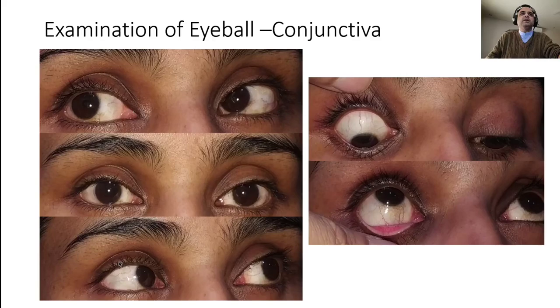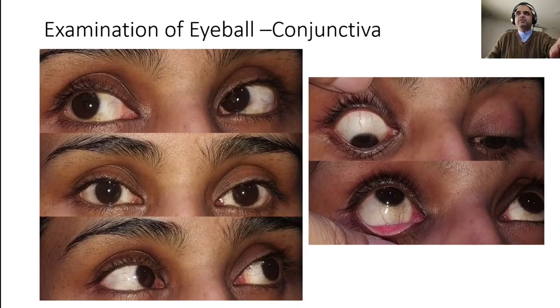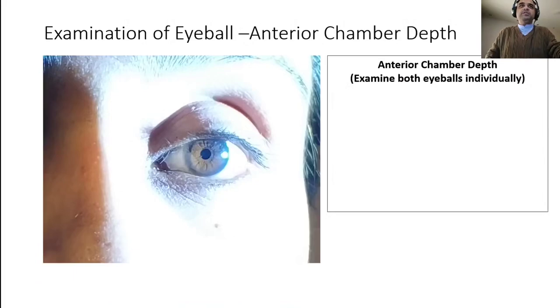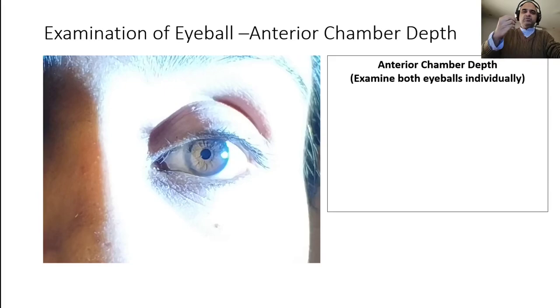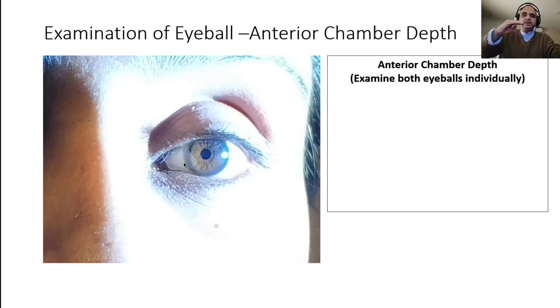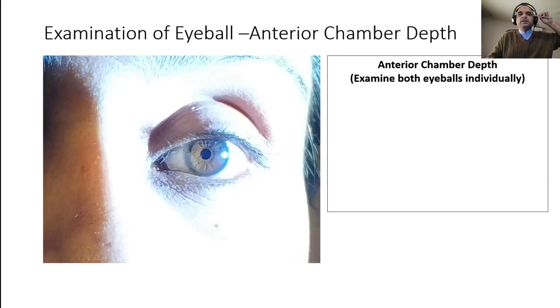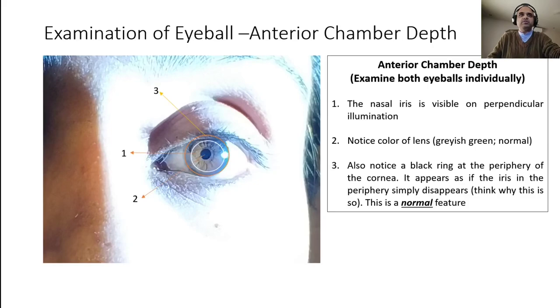Finally we check the anterior chamber depth. After checking the conjunctiva, cornea, iris, pupil, and lens, we assess the anterior chamber depth. The anterior chamber helps drain the aqueous humor through the trabecular meshwork into the Canal of Schlemm. The trabecular meshwork is located in the anterior chamber angle — the angle between the iris and the cornea. If the anterior chamber depth is shallow, aqueous doesn't drain well from the eye.